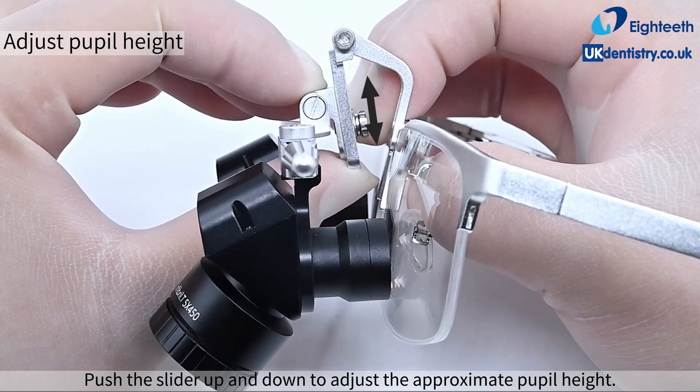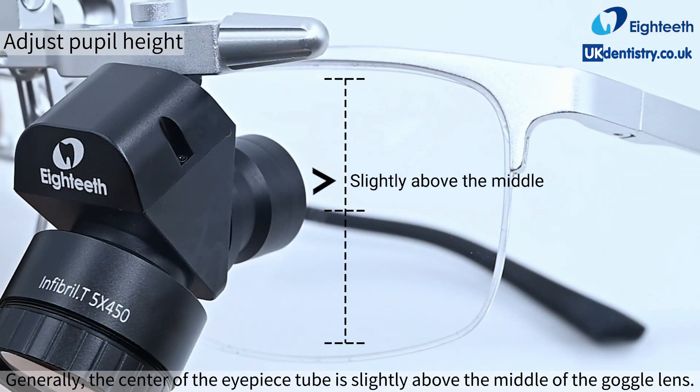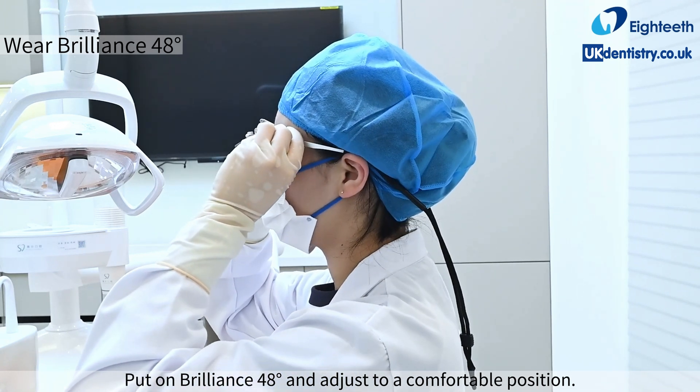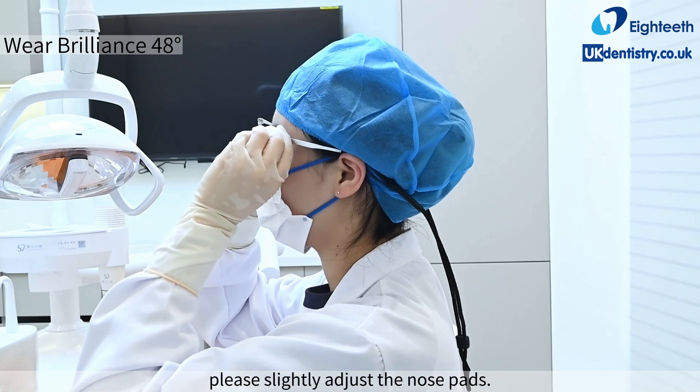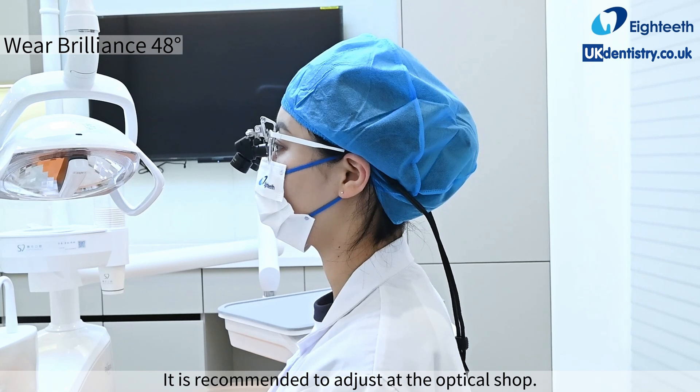Push the slider up and down to adjust the approximate pupil height. Generally, the center of the eyepiece tube should be slightly above the middle of the goggle lens. Put on the Brilliance 48 degrees and adjust to a comfortable position. If it does not fit the bridge of the nose, please slightly adjust the nose pads — it is recommended to adjust at the optical shop.